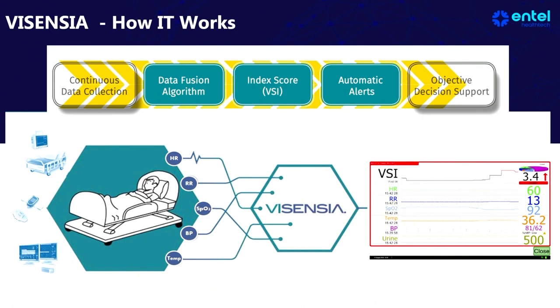So what it does, it has continuous data collection of all the vitals: pulse rate, respiratory rate, SpO2, blood pressure and temperature. Basic vital parameters, and they put them into a single number, and the single number gives you ideas. If the single number is more than 3, then the patient is mildly critical. If more than 3.5, then the patient is very critical. So it just pops up that this patient has a blood pressure shooting up, or the heart rate is coming down, or the patient has a high-grade fever. So at least that gives you an alarm. So this is AI.